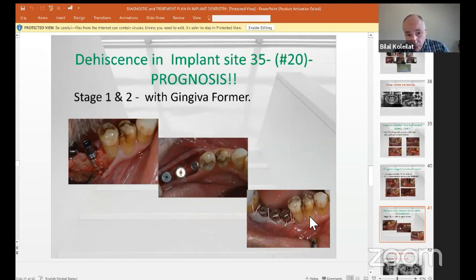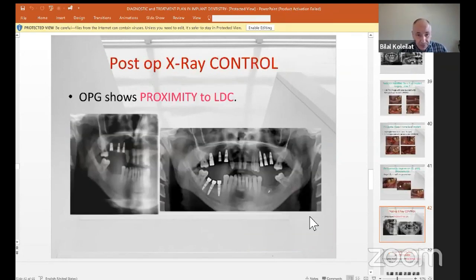When placing the implant, you know it always needs to be under-prepared, especially in a socket grafted area. You can see that I have a complete buccal dehiscence. Decortication has been performed to re-graft this area by using xenograft particulate with the barrier membrane and closure. But unfortunately, I can tell you that this first implant has failed, and we have only left these 2 molar implants.